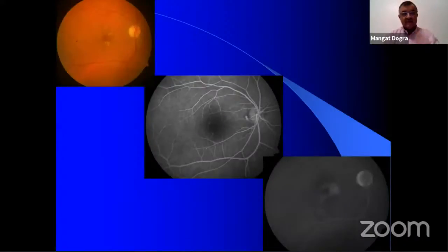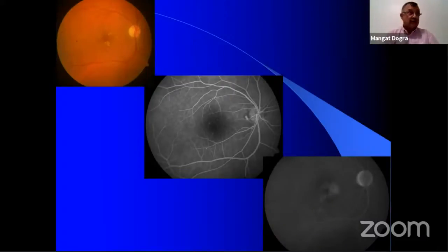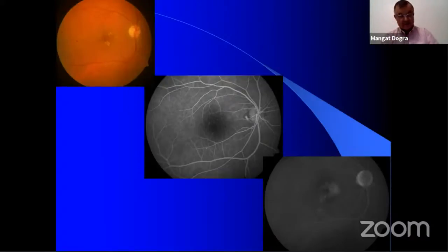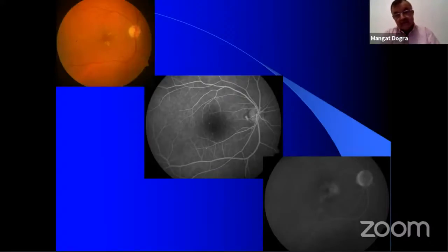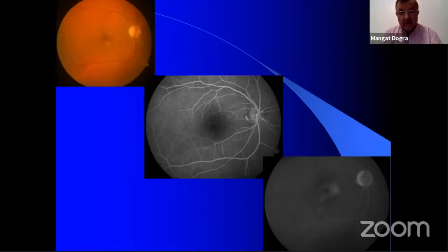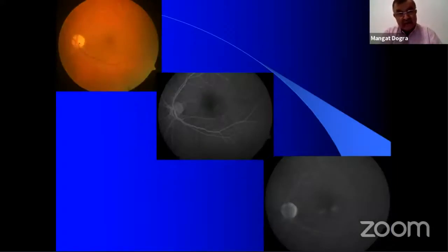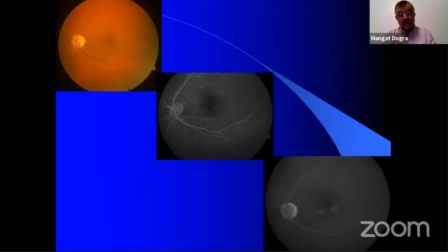Whenever we want to interpret an angiogram, we also need a fundus photograph — don't interpret it independently. This is for any comprehensive ophthalmologist: you must look at the fundus picture or the fundus itself, and then interpret it. Early and late pictures are very important. He nicely showed how diffuse leakage or CME is seen, demonstrated on the OCT picture. In the left eye, you can see focal leaks away from the center, leaking in the late stage.